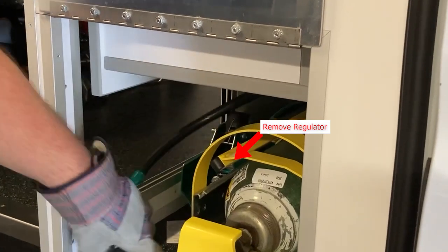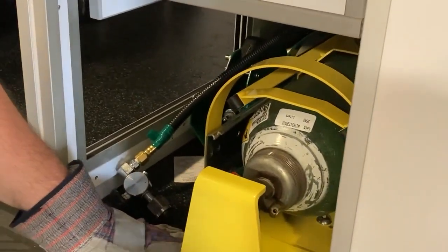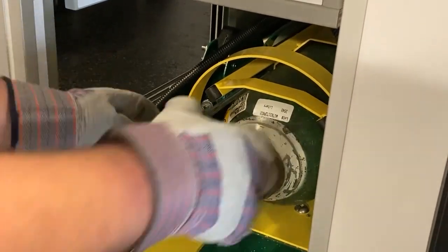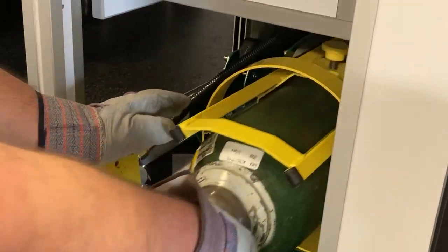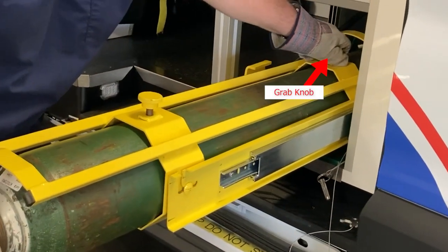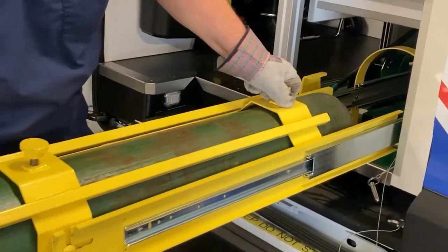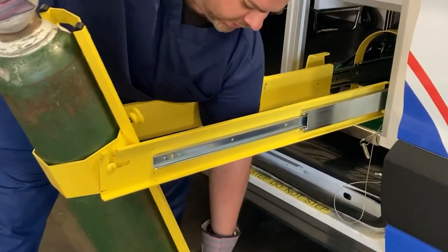So to remove, once you remove the regulator, you can pull the pin, put that off to the side, slide this open. Grab the bottle, pull it out, once you can, grab the knob, make sure it's tight, slide this out all the way, and then bring this down.